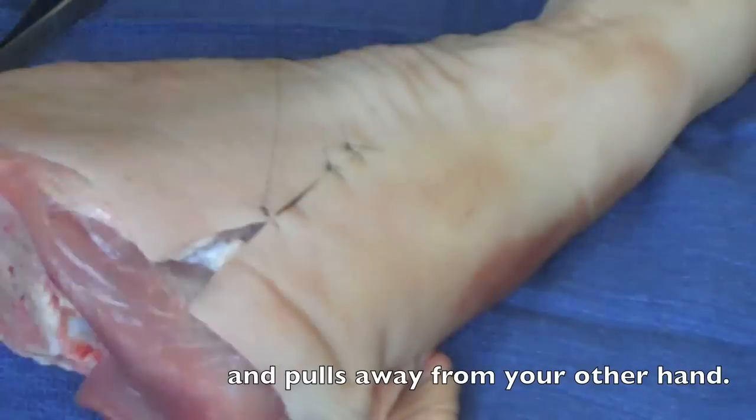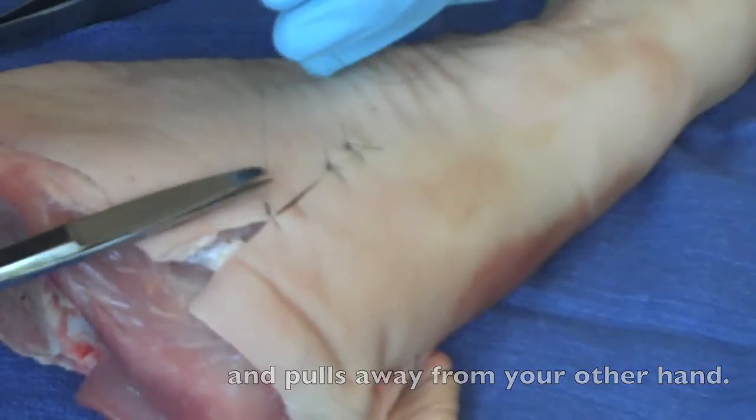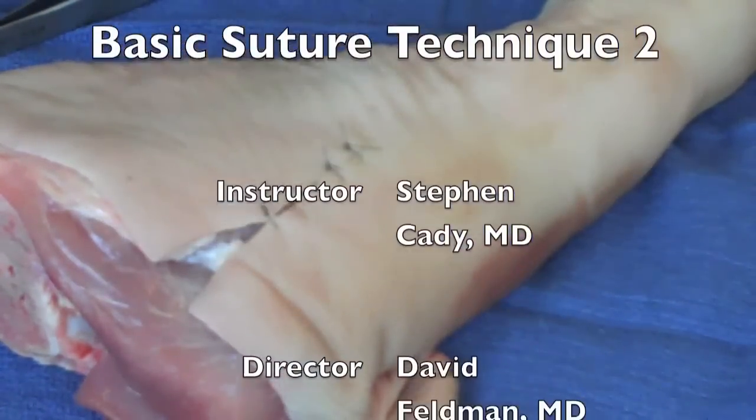We're trying to bring up the wound edge as best as possible. Maybe a few extra knots on there for demonstration, but keep a nice tail on that wound as well. Never want to cut the tails too short, and don't want to leave them too long.